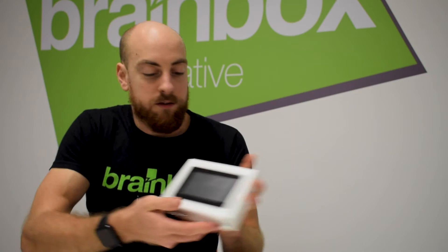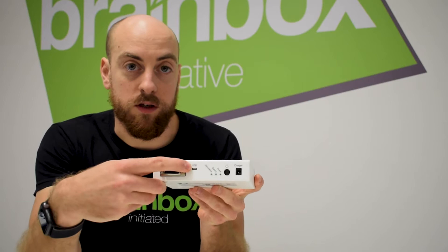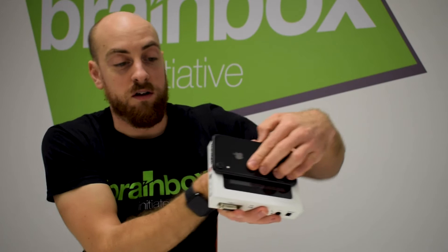The first thing jumping out is the stimulator module itself. Controlled by the touch screen, we also have the 15-pin D-type connection, USB connection to the computer application, the power button, the charging port, and the two touch-proof connections for the stimulator module. It's a fairly compact device — for size comparison we can look at a standard iPhone and you can see it's not much bigger.